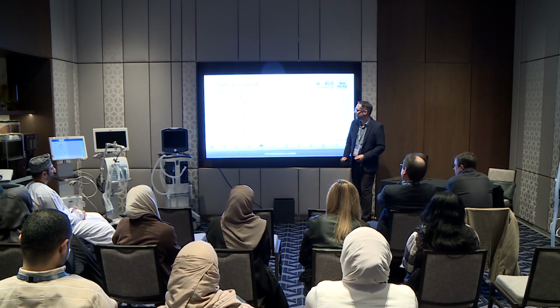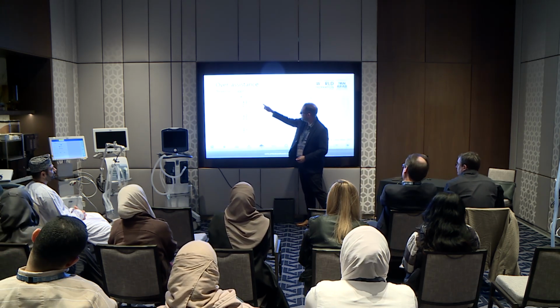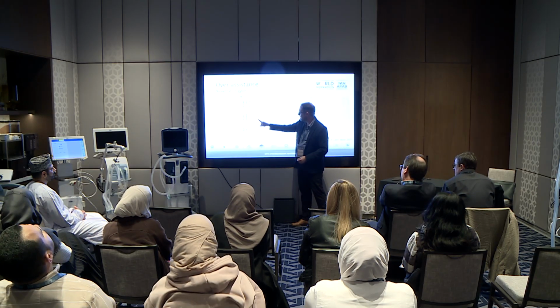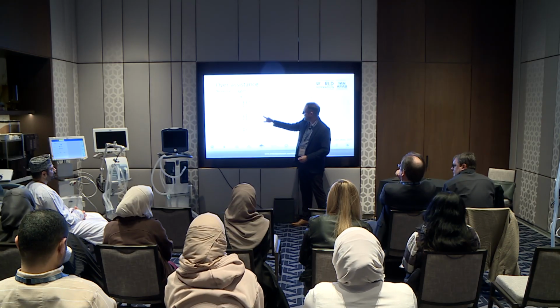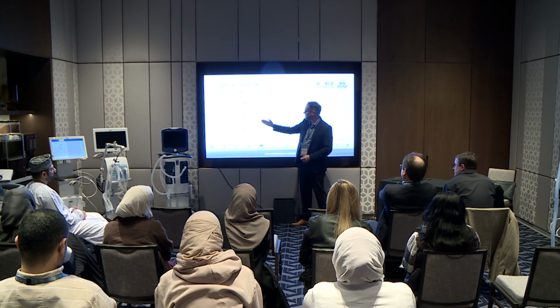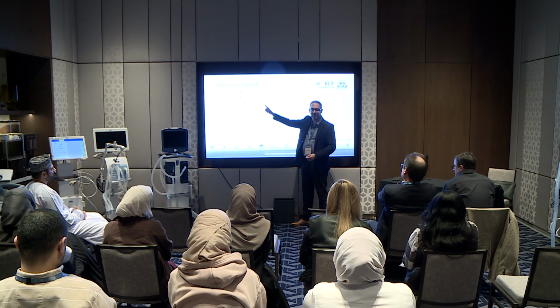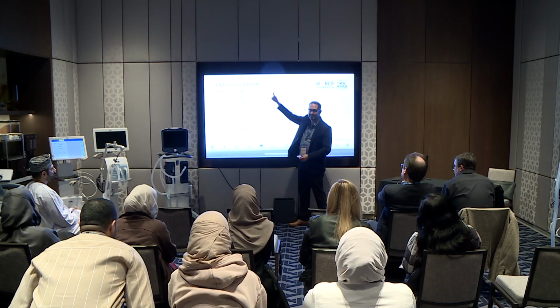Okay, reverse triggering. I mentioned the machine gives a breath. There's evidence of PMUS, so this is pressure control. The machine gives a breath. There's no evidence of trigger, so A is pointing at the point where it doesn't look like they're triggering the breath. It gives the breath, and then again, in pressure control, I'm not expecting to see many changes in the pressure waveform. I'm expecting to see it in the flow. Remember the equation of motion? Look what the flow does. It starts to decelerate and goes back up.